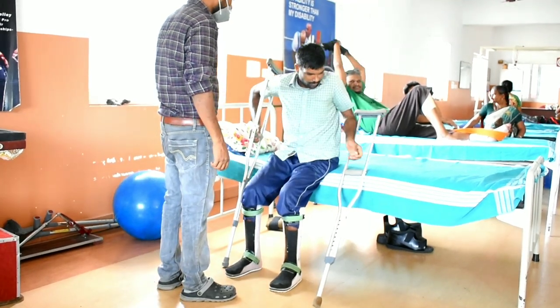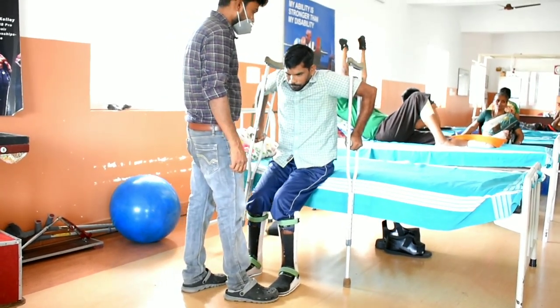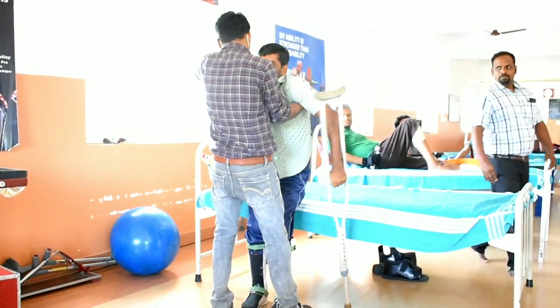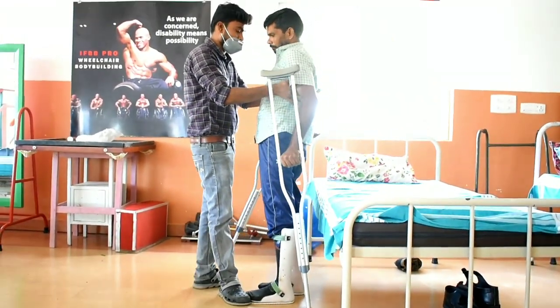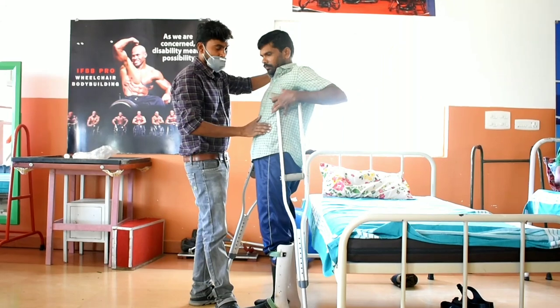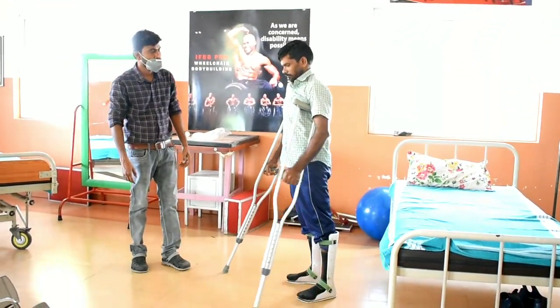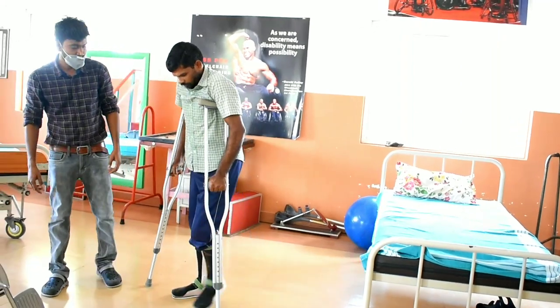Regarding transfers with axillary crutches, one technique is that the person can hold both axillary crutches in one hand and hold the bed with the other hand to come to standing. In his condition, this is difficult because he has fair lower limb power on one side and good on the other, which causes him to fall. With mild assistance and training he may be able to stand and walk, but considering the complications of crutch palsy and the need for support during transfers, axillary crutches may be difficult.